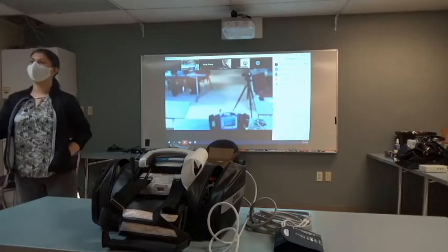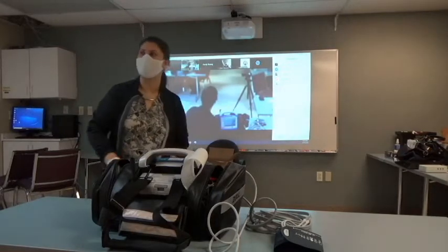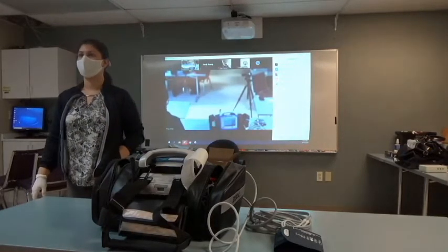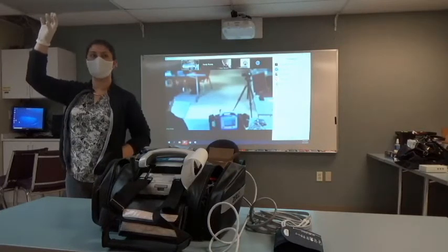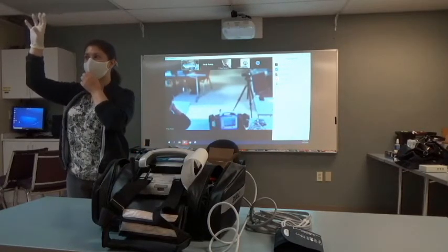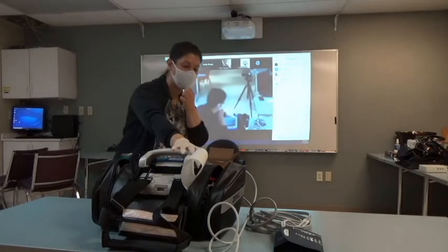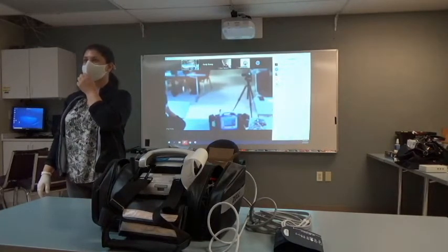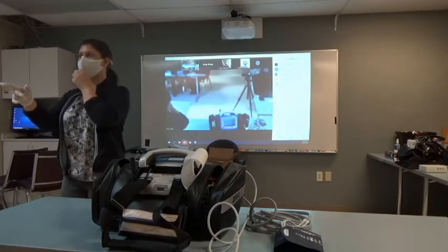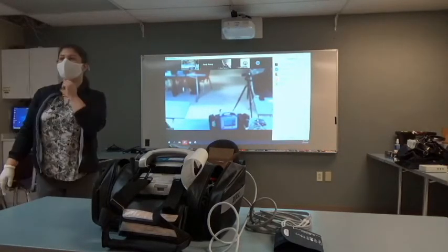So to recap really quick, that purple arrow is the page flipper. There is a blue circle just above that. That blue circle is your view changer. The blue circle allows you to toggle between your V leads and your limb leads. Are we good over here now? Yeah. Thank you.